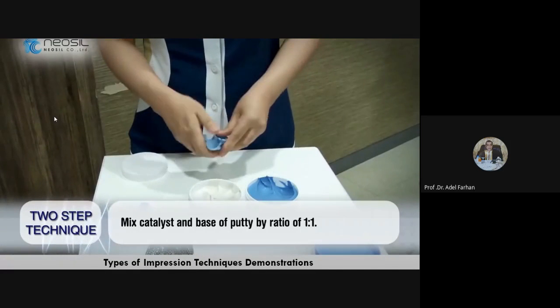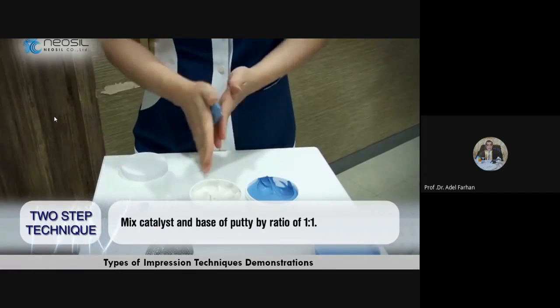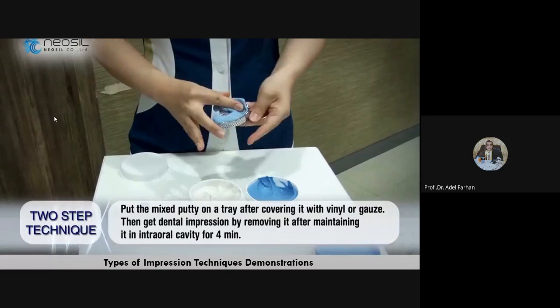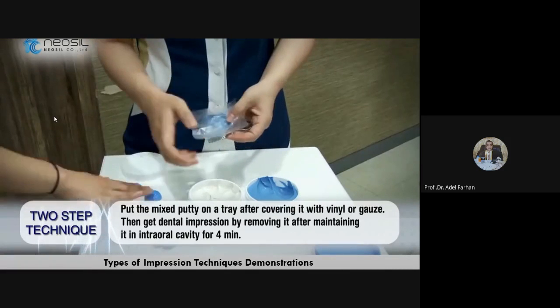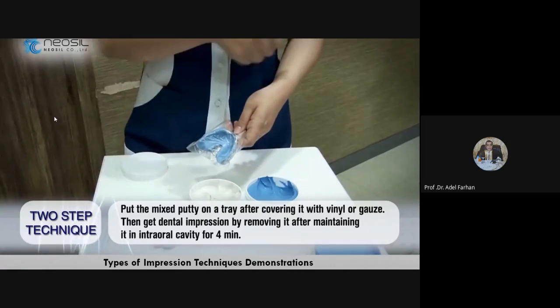After complete mixing of the catalyst with base، وين راح نخليه؟ You load it in the impression tray. طبعا لما نشوف هذا شنو خلينا؟ polyethylene spacer. راح ناخذ impression بالهيفي.